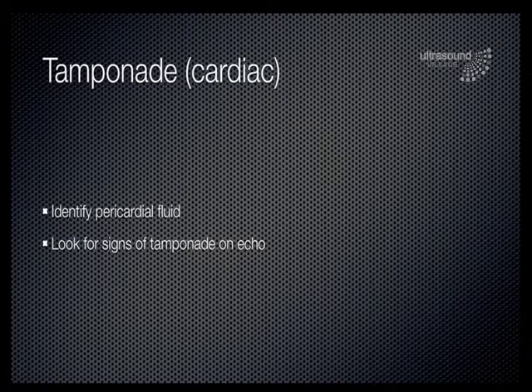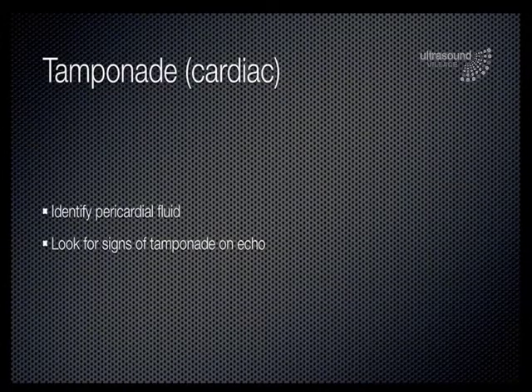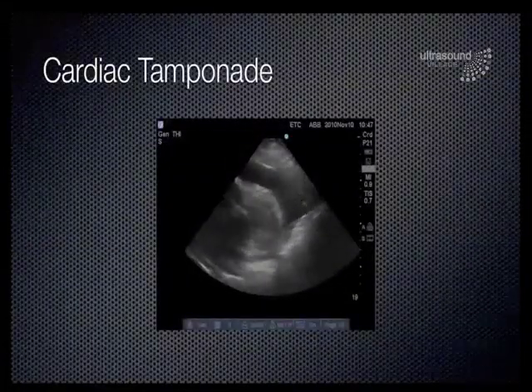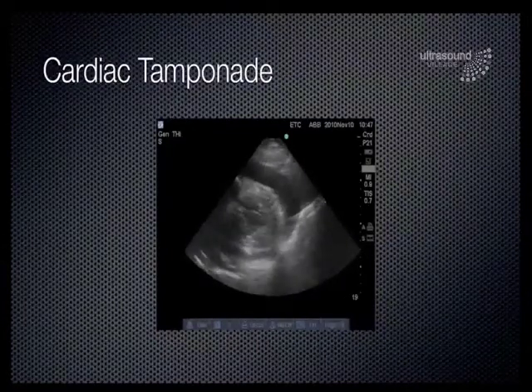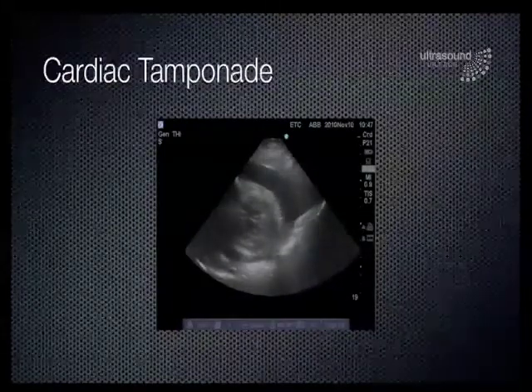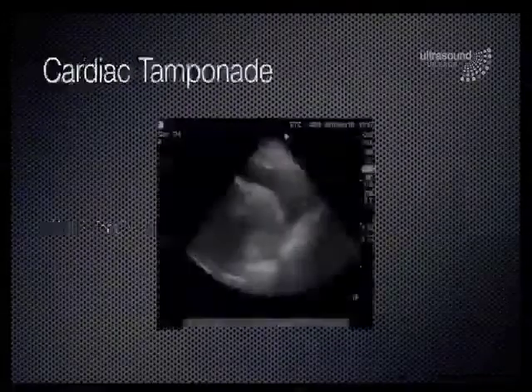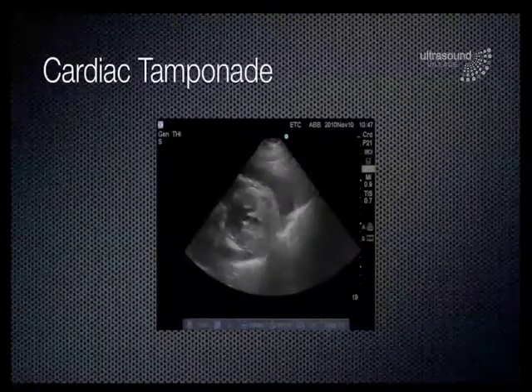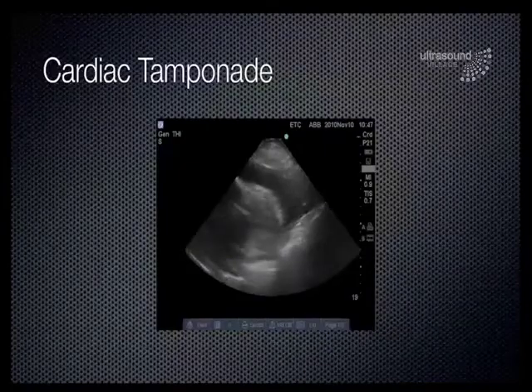Cardiac tamponade can be identified on echocardiography. The identification relies on presence of pericardial fluid and echocardiographic signs of tamponade — namely right ventricular and right atrial collapse. This example is a scan performed during a 10-second pulse check of a patient in pulseless electrical activity, showing a large pericardial effusion and very poor left ventricular contraction. This particular case was a post-myocardial free wall rupture.